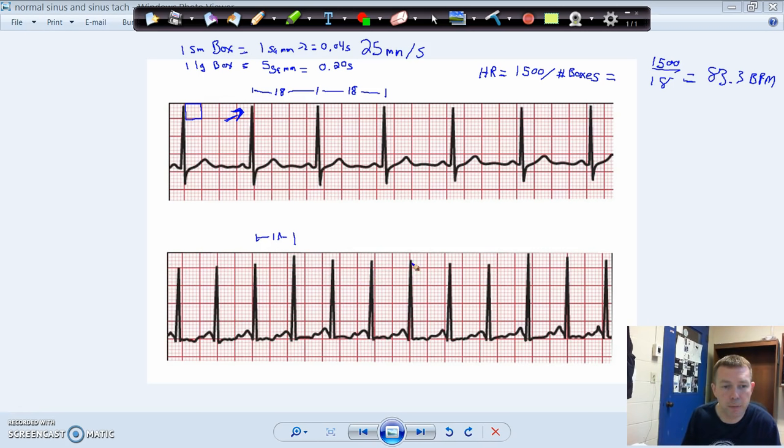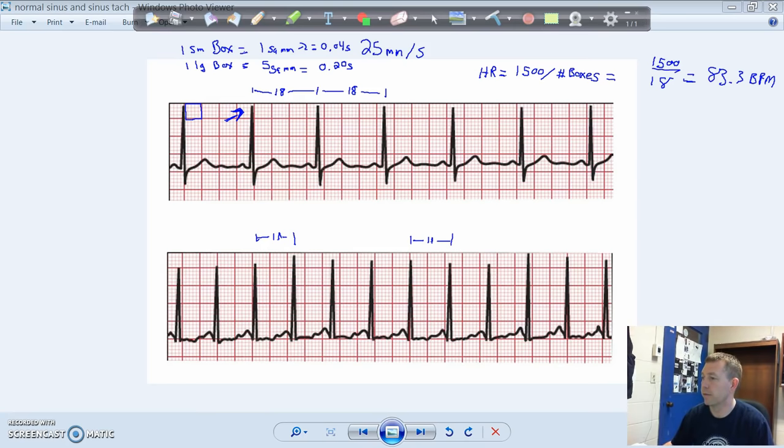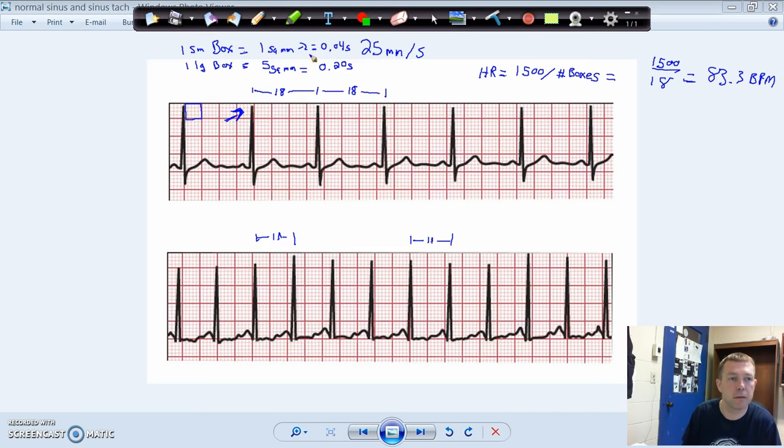You know, this one starts right on a black line, so 5, 10, 11. Yep, between here and here is 11 again. So we know that there are only 11 boxes per cardiac cycle on this one. So 1,500 divided by 11 is going to equal, this is a good one, 1,500 divided by 11 this time is going to equal 136, 136 beats per minute.